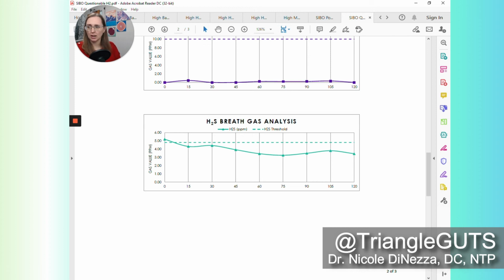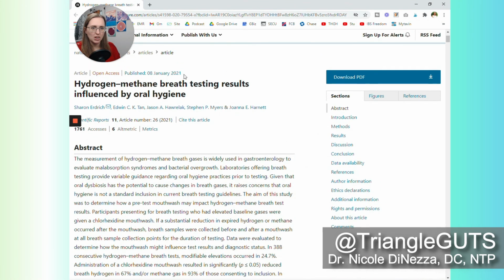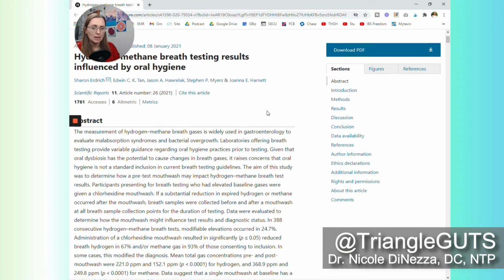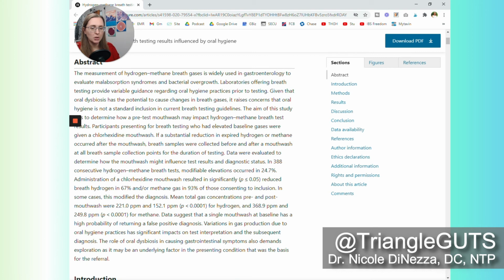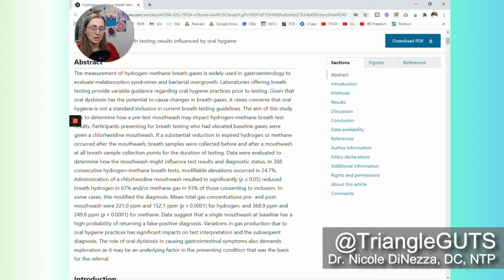There was a study here, and I'll drag it over to my window. The guy who is oftentimes known as the probiotic advisor, his group did this recent study, this was January 2021, where they said hydrogen methane breath testing results are influenced by oral hygiene. And they basically showed that if you have patients collect their SIBO breath tests, but you administer a mouthwash before each sample, it significantly reduces the breath hydrogen and the breath methane, and it makes the results much easier to interpret.